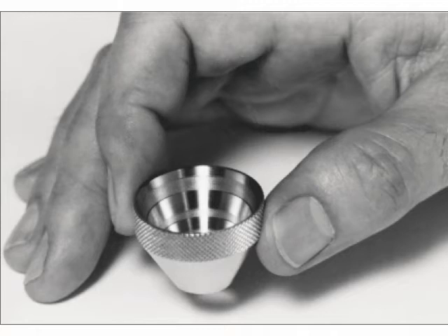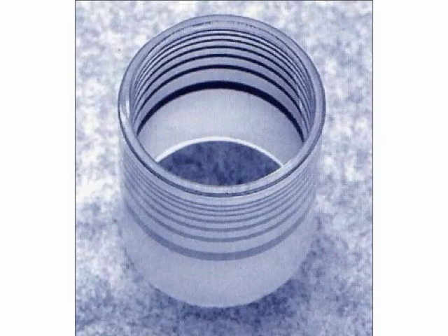This is a different sort of keratometer that we might use during surgery, and it also has concentric rings that, using the illumination from the microscope, projects rings onto the patient's cornea, and we can assess curvature like that. This is a Van Lunen keratometer.